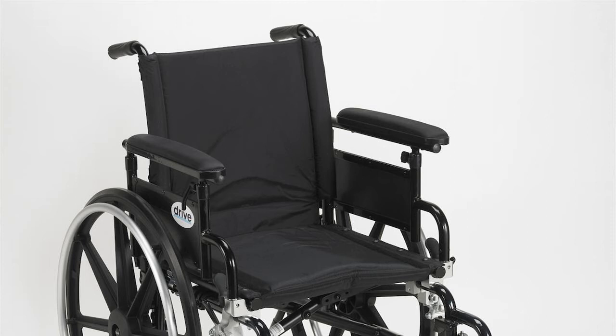Step 2: Lift straight up on the front rigging and remove it from the chair. Repeat for the opposite side.